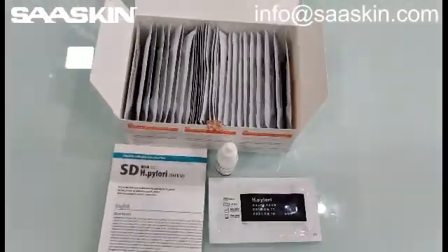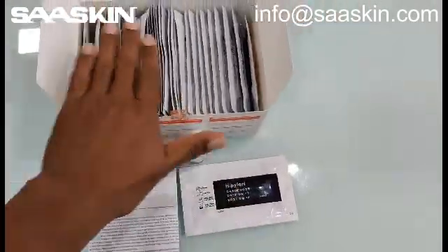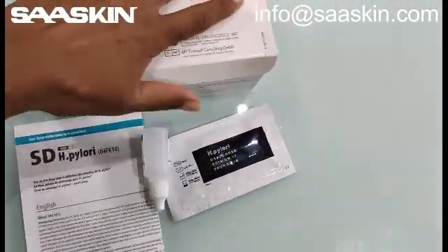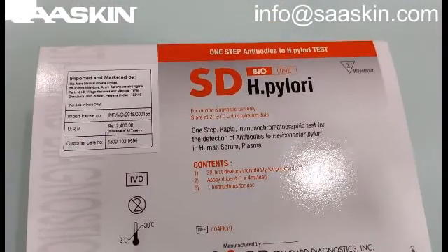Let me quickly recap. The complete box contents are: one instruction manual, one buffer bottle, and 30 test cassettes. This is the whole introduction about the SD Bioline H Pylori test cassette.